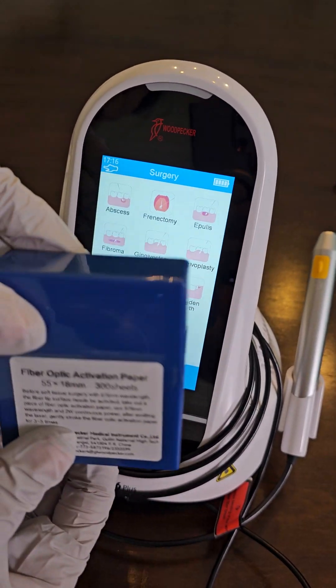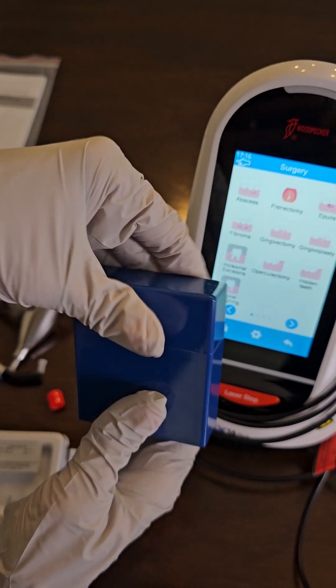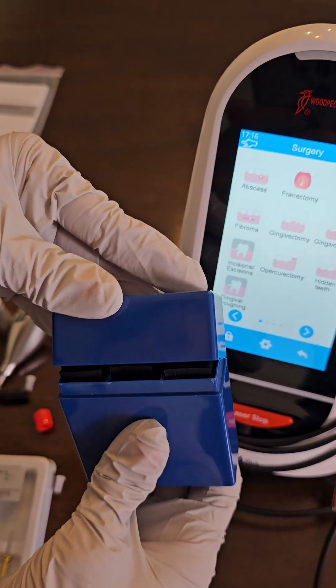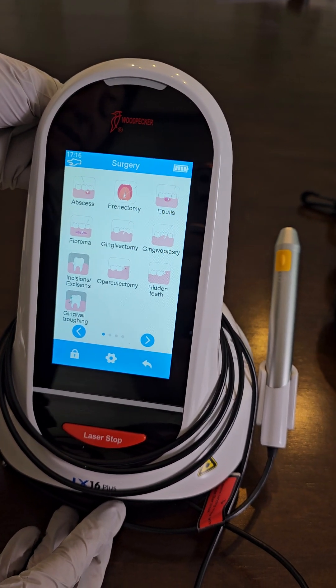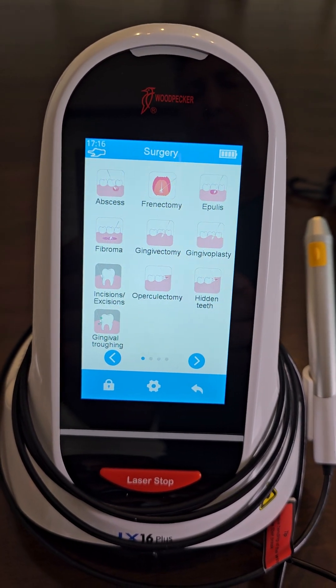It also comes with some blue articulating paper should you want to initiate your tip. You do not need to initiate the 445 or the 450 wavelength. And this is how easy it is to set up your Woodpecker laser.